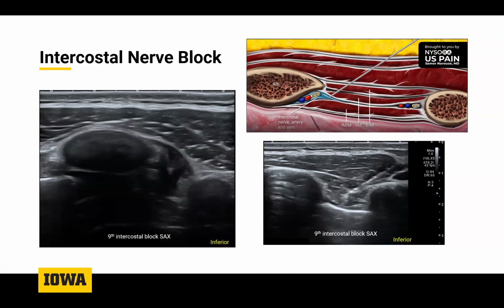Right. I would say one thing that Ben taught me here that I think is great, and you kind of mentioned it too, is the rib counting, but the marking. I never really brought a marking pen out before, and that's a great trick, to mark the painful spot and then mark a couple of ribs, because there's not a quick way to orient here. You're usually in the middle of nowhere, right? Ben showed you how to find it from the top and from the bottom, but you're usually working right in the middle, and it's a pain to keep going back and forth counting ribs. So just put the marking pen on, and that way you can quickly orient yourself, and it probably cuts your scan time in half if you care to comment on which rib level you're at.